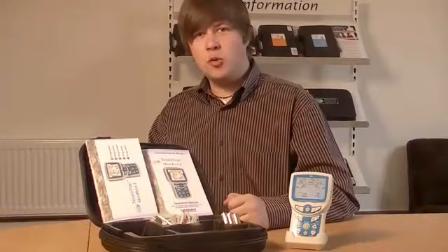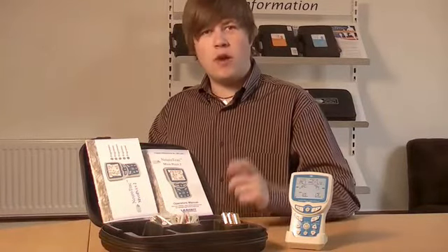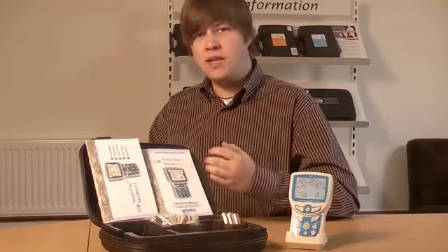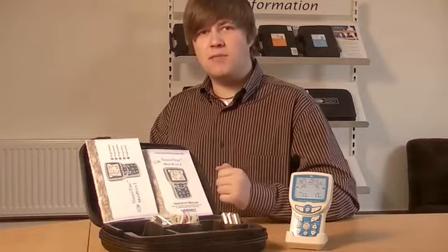In the manuals, you'll find all the necessary information on how to work with your device. There are 2 manuals. One is for selecting your program, and the other, called the Operator's Manual, is for basic and advanced functionality. From this manual, you can find out how to do things like lock the device, so that the patient cannot change the program when working at home or in a clinic.